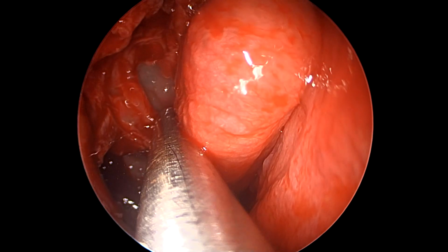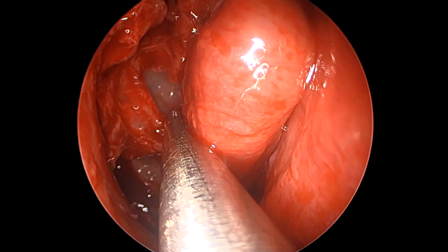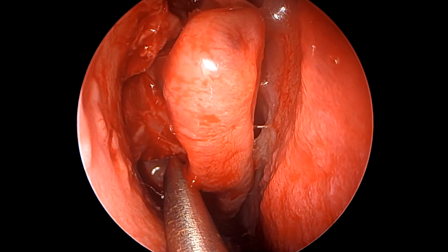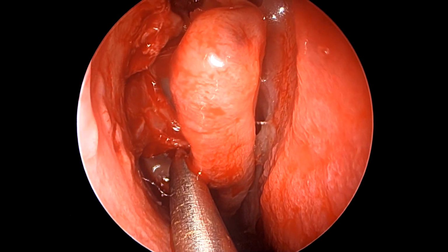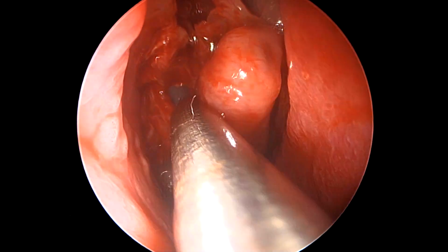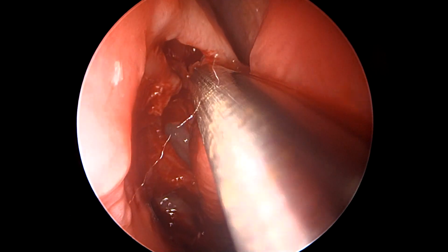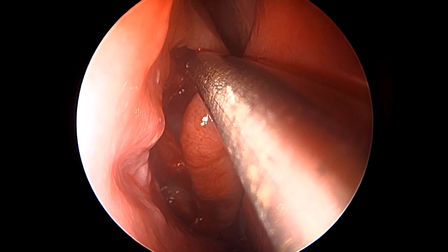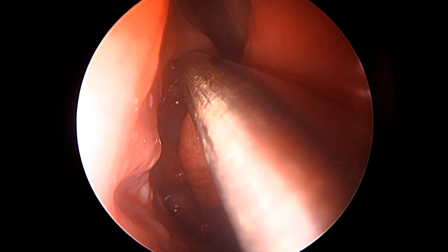We are taking a navigator probe now and touching it in contact with the basal lamella. As you can see, we are taking a trajectory which matches the transitional antrostomy ridge, which is this, as you see here, which we are pointing. And the transitional antrostomy ridge points us towards the basal lamella, or the entry point into the posterior ethmoids from the basal lamella.